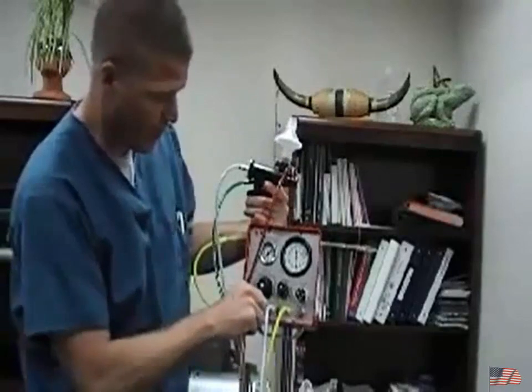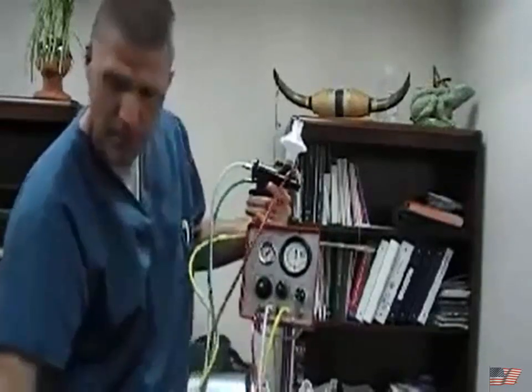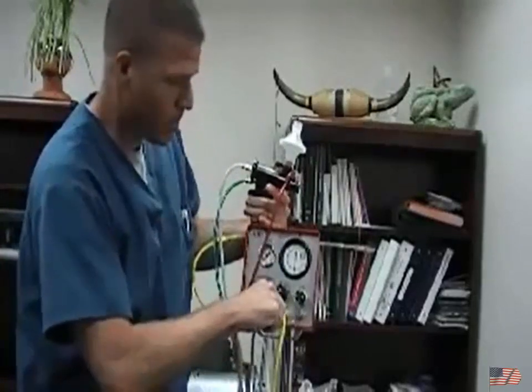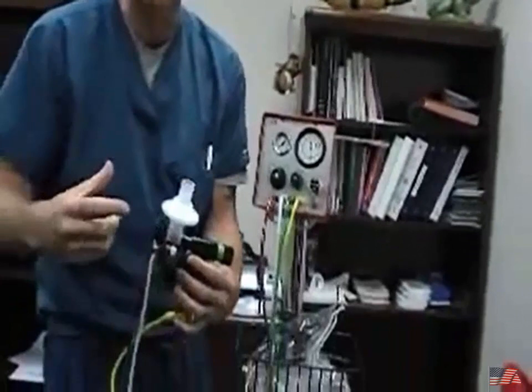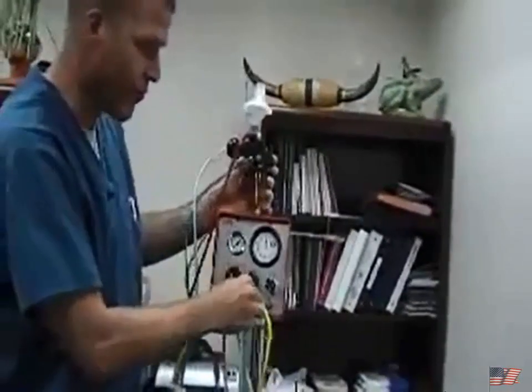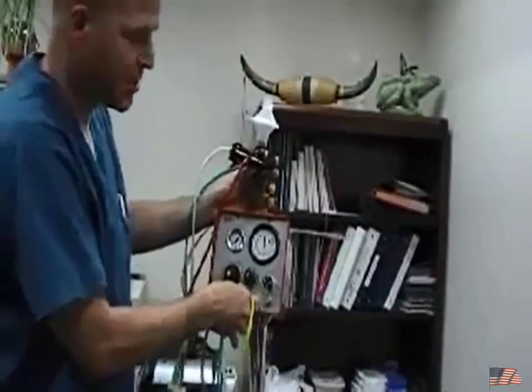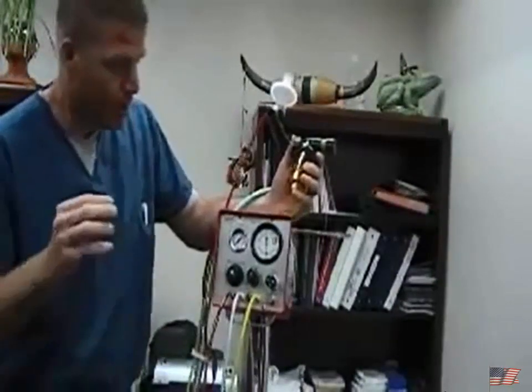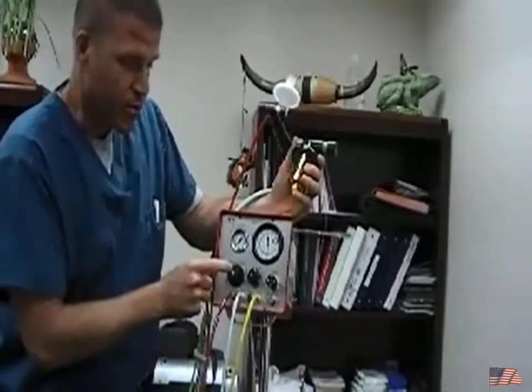This is your accessory gauge, okay, your manometer, and this would be your remote line here. So when this is activated, if I just hit that button, it interrupts flow and will stop the machine there. But since we're not going to use it, we'll just disconnect that and it'll just be in continuous cycle.